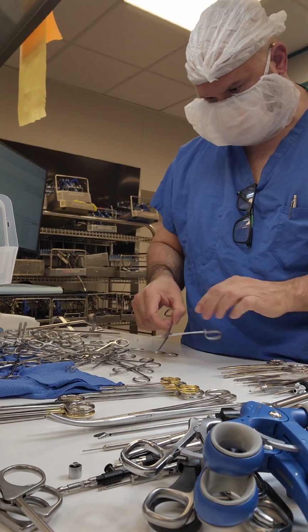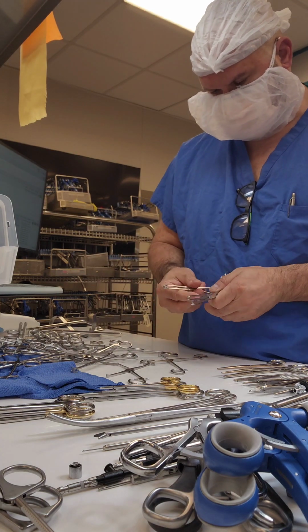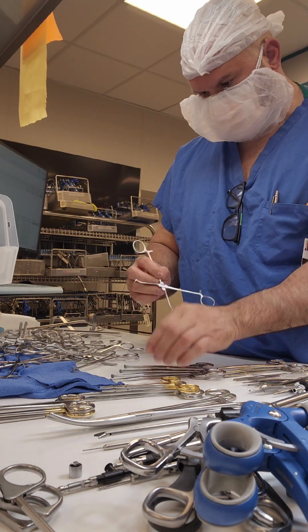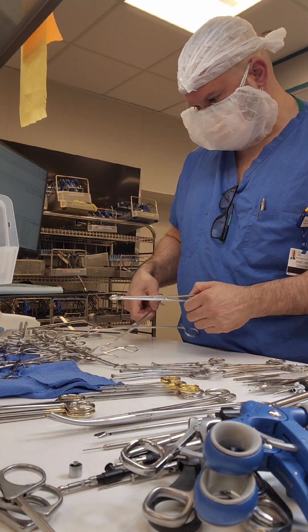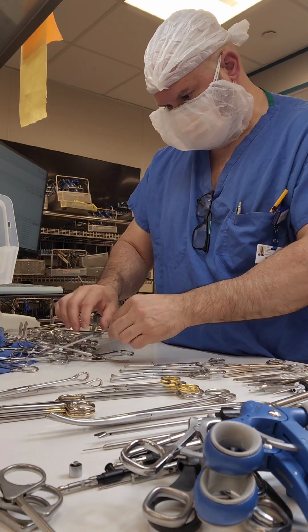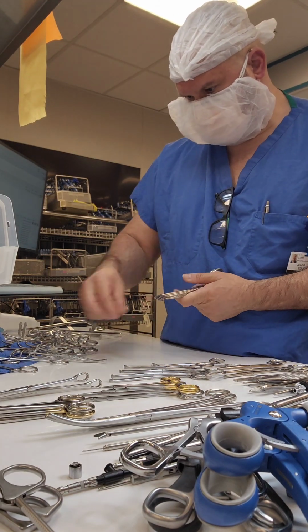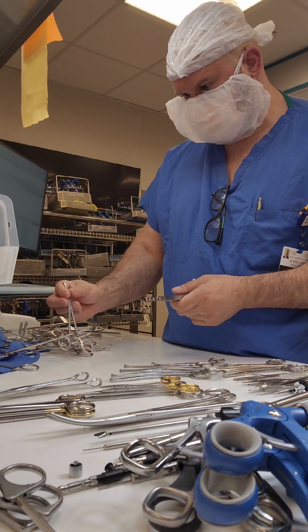So I'm very touchy-feely with my instruments because that is part of my inspection process, right? I also get to feel how those instruments feel. As you can see, they're in an open position. I'm kind of closing them up. I can feel if one is stiff and requires some instrument milk to relubricate them. So you want to optimize your workstation, right? So you don't want things in the way. So you want to go ahead, grab all these instruments, pair them up, put it together.